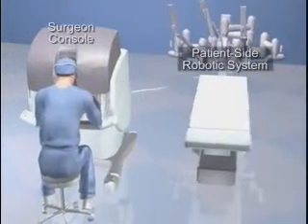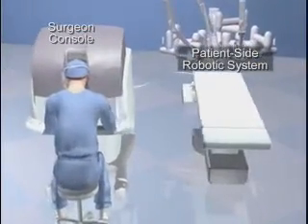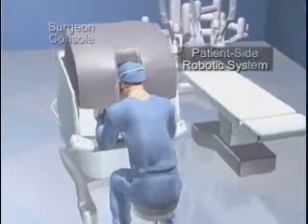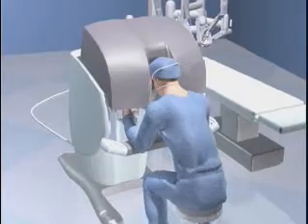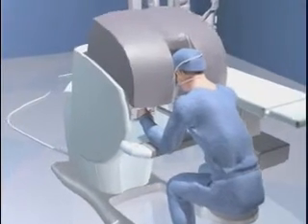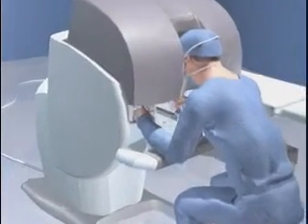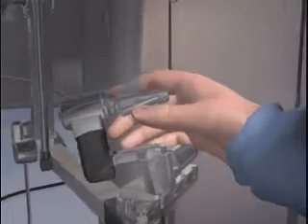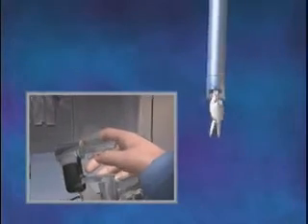The DaVinci Surgical System is a state-of-the-art medical device comprised of a surgeon console and a patient-side robotic system with a high-resolution camera and micro-instruments used in surgery. The computer-enhanced system scales the hand movements of the surgeon at the console down to micro-movements of the surgical instruments on the patient-side system.